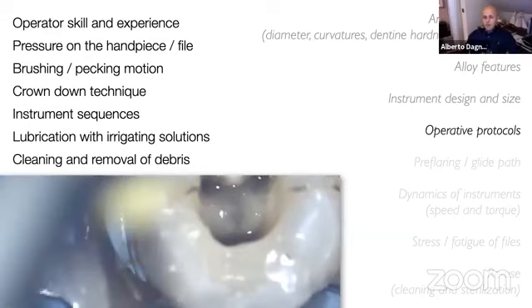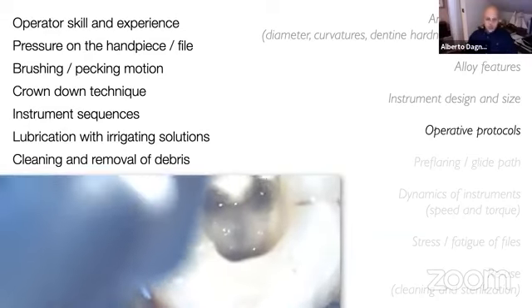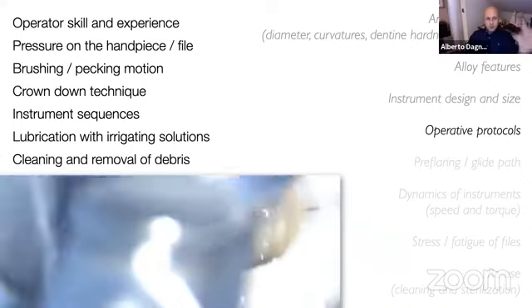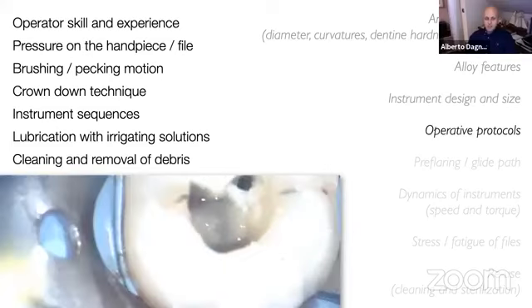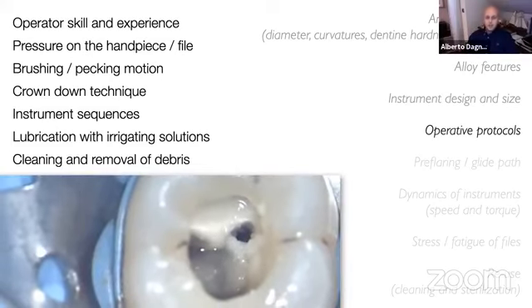And we have to respect many operating protocols. Literature agrees on operator skill and experience as a crucial factor in preventing separation inside the root canal. But we have to modulate the pressure of the file inside the root canal.